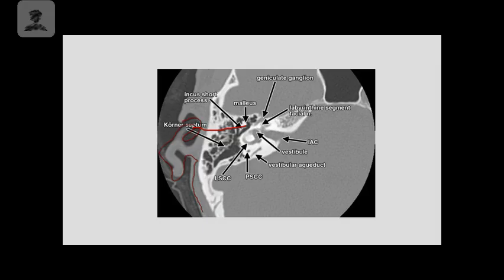We'd be able to see it, and then we could see where the eardrum is, the incus, the stapes, the malleolus, or the malleus. I never say that right. And then here is a really good example of internally, we can see the internal auditory canal. So through those different slices, we'd be able to identify all of those small bones, as well as is there anything going on? Do we have a mass in the area?